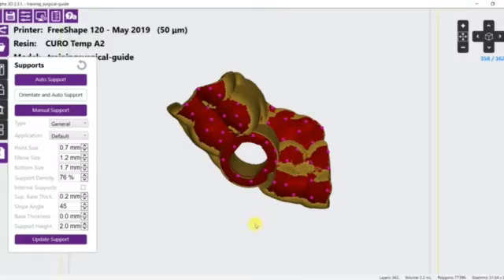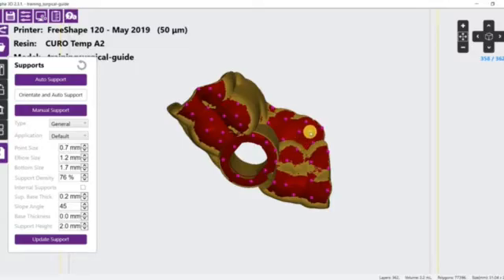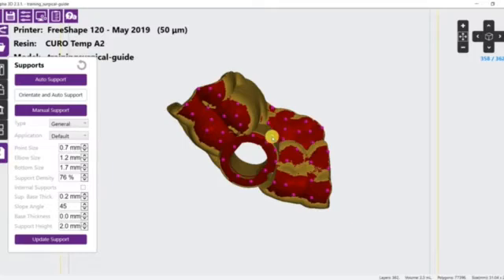Adding supports is as simple as clicking the manual support button on the supports panel, and then clicking on the surface where the support is needed.